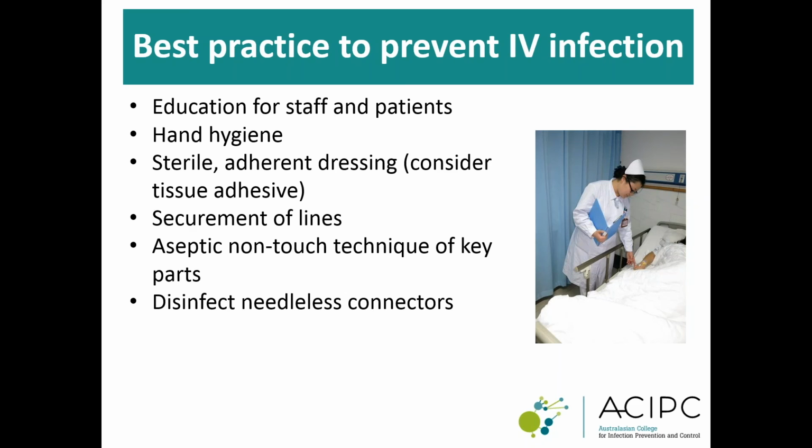Evidence-based cannulation training, theory and simulated practice, combined with a subsequent period of supervised training in the workplace, are great learning procedures to help inexperienced novices become fully competent. Research has shown that intensive education programs can improve overall cannula care, leading to significantly decreased incidence of bloodstream infection. Furthermore, staff should educate patients to look out for early signs of infection at the cannula site to help early detection. And if a patient is going home with an IV access device, the patient and their carer should be taught techniques to prevent infection before discharge from hospital.